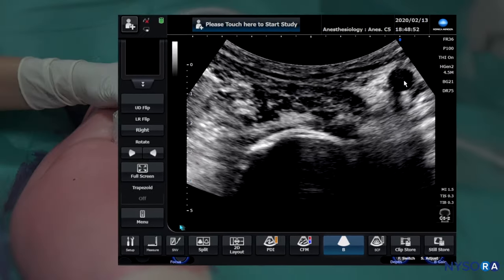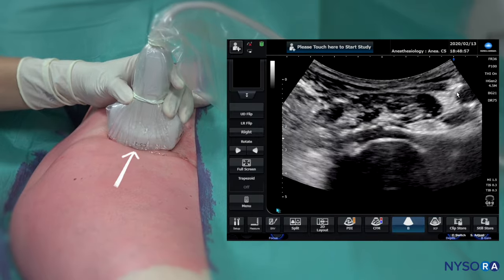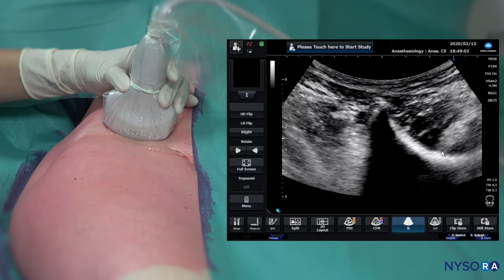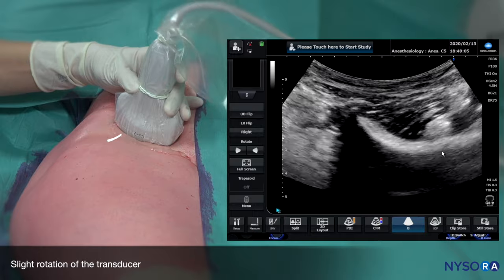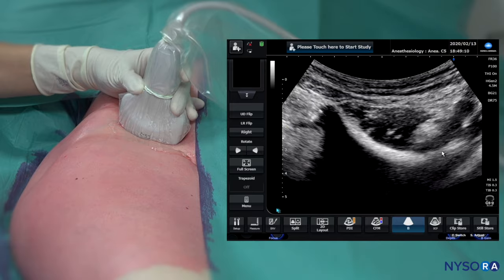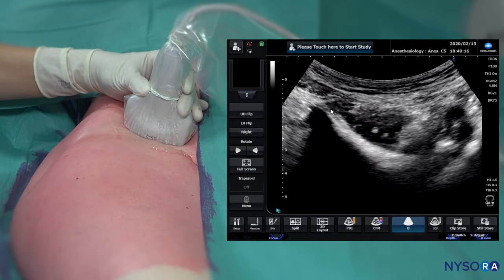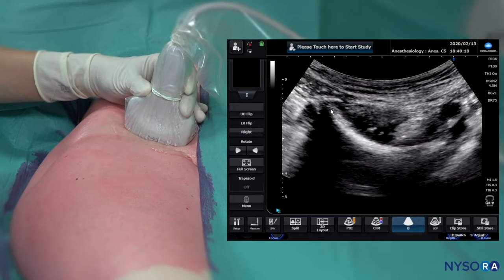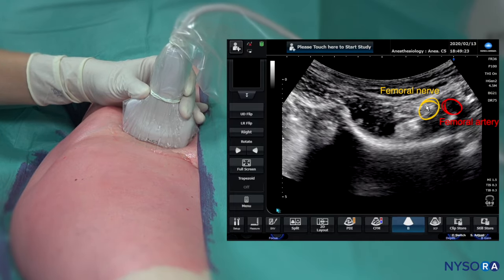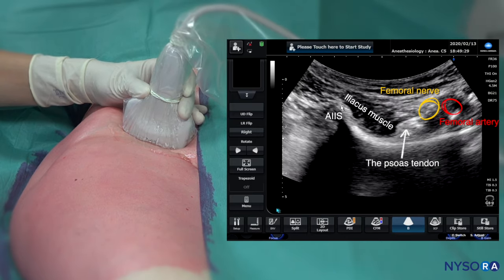Once we see this image, we want to go slightly proximal until we lose the hip joint and we start seeing the pubic ramus. We have to continuously keep the femoral artery and femoral nerve in view. That now in the image is the anterior inferior iliac spine. Our goal is to adjust this image so we can clearly see the femoral artery, the femoral nerve, the psoas muscle tendon, the iliacus muscle, and the anterior inferior iliac spine.